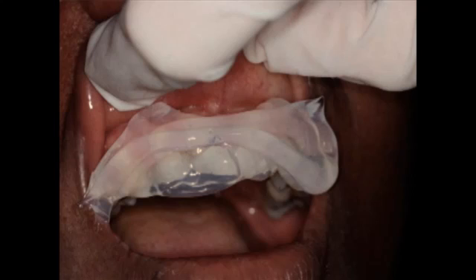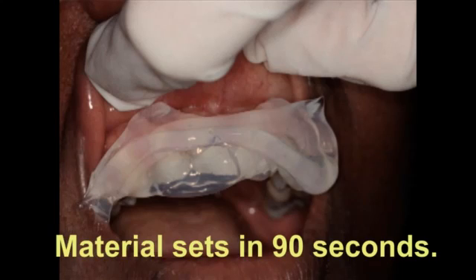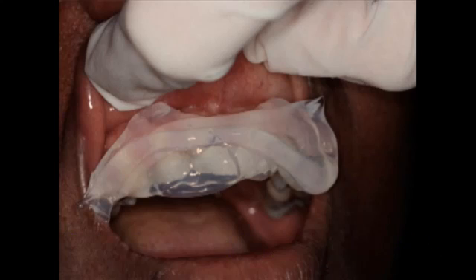So what do I do? After anesthetizing the patient, I make an impression with a clear polyvinyl siloxane bite registration material over the maxillary anterior 8 teeth, labial surface, incisal surface, and lingual surface, and I also get up 3 or 4 millimeters onto the gingiva. This is done without a tray. This material sets in about 90 seconds in the patient's mouth, so by the time this material is set, the patient may not even be anesthetized to have the teeth started to be prepared.